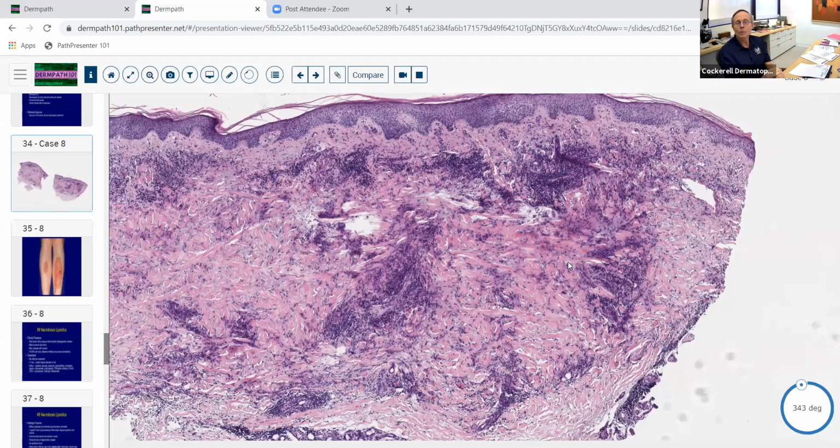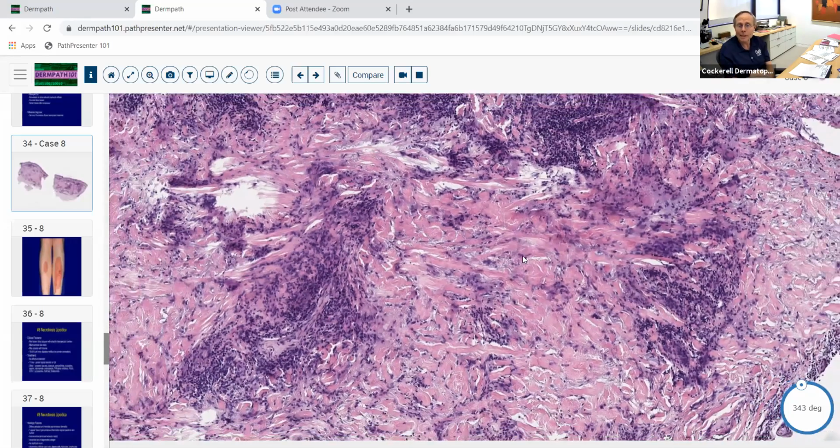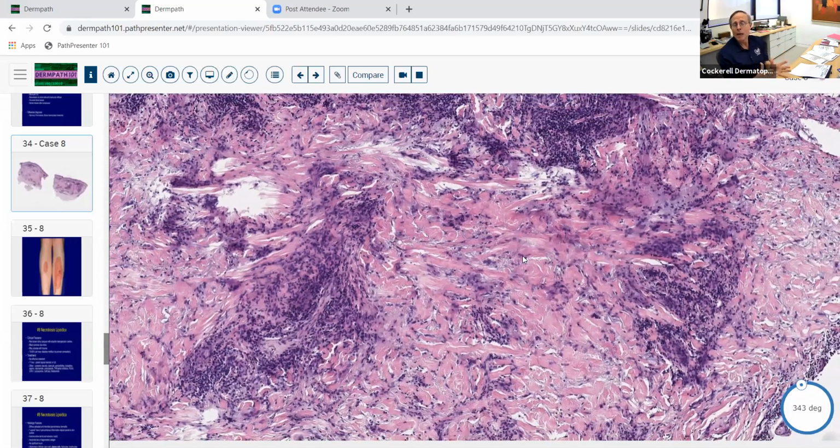Okay, so they refer to that as being palisaded. So that's a palisade of those spikes sticking around whatever is in the center of that. So it protects you. So we've got histiocytes that are forming these little palisades here. And these maybe are the Indians out here, and the soldiers are in here, and they're nice and safe now. But basically, you want to see what's in the center of the palisade to help make the diagnosis. And there's usually, in the three classic palisaded granulomatous dermatitides we think of granuloma annulare, necrobiosis lipoidica, and rheumatoid nodule.